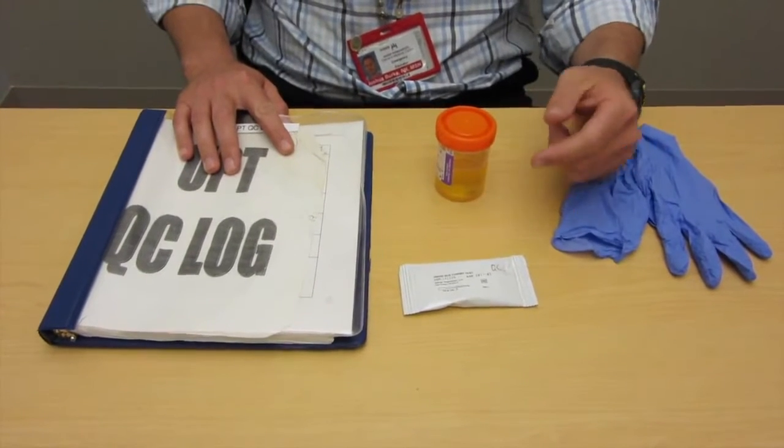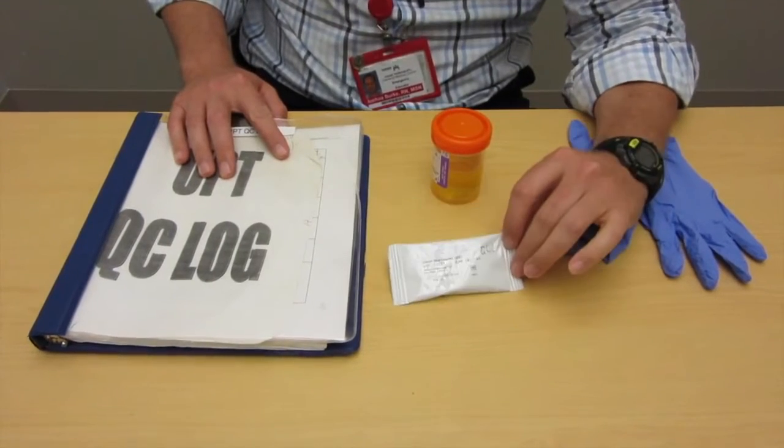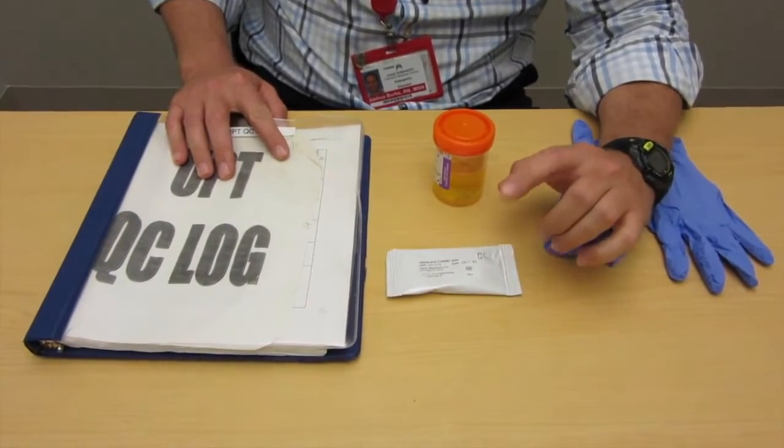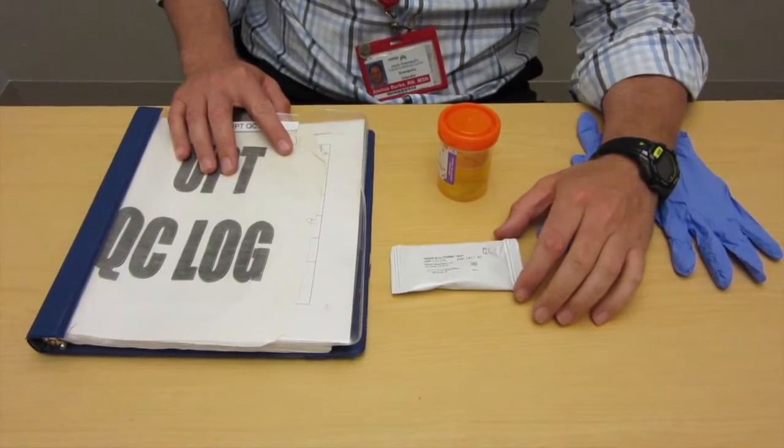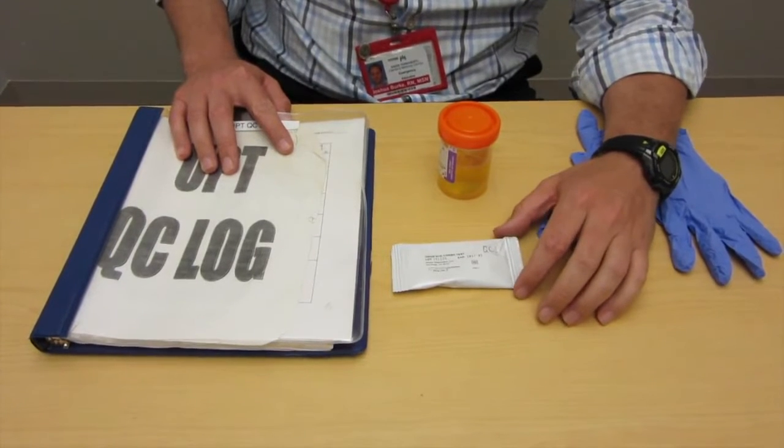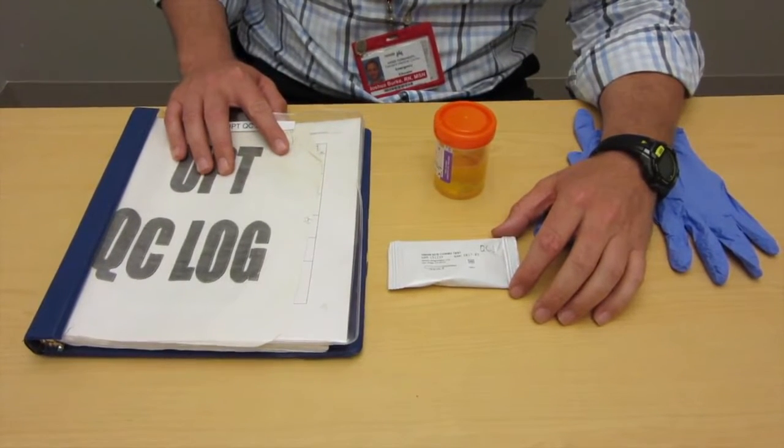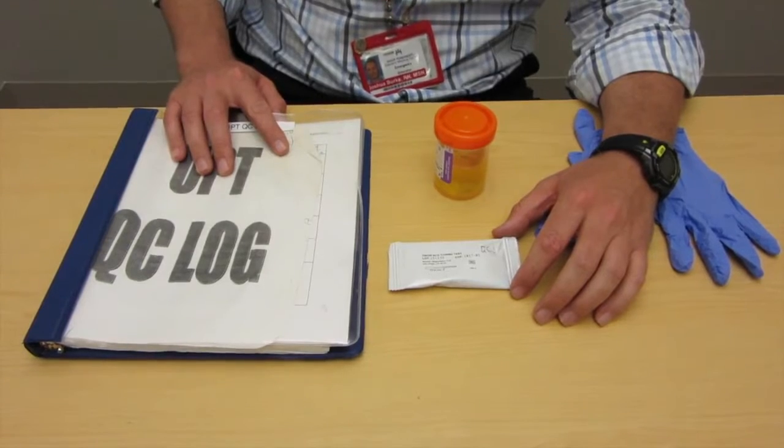Okay, so here's a quick introduction to the urine pregnancy test kits that we use at both campuses. These are essentially OSIM HCG combo tests and they give us a result of pregnant or not pregnant qualitatively within three minutes.